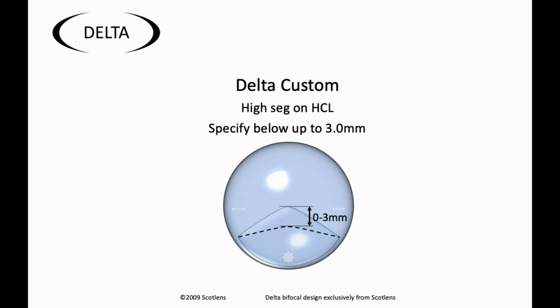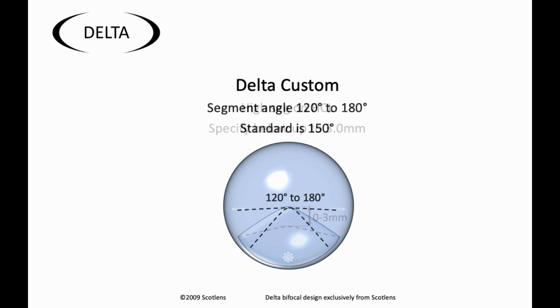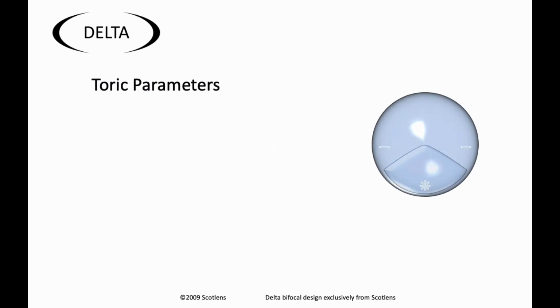You can customize the reading segment either from a high segment, which is on the HCL, to 3 mm below the HCL. And you can also alter, if you need to, the standard angle of the segment, going out to 180 degrees, effectively a flat executive style, or you can bring the segment down to 120, but standard is 150 and tends to be fine for most applications.